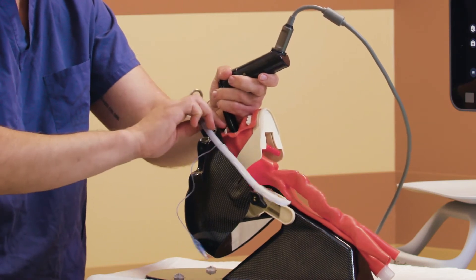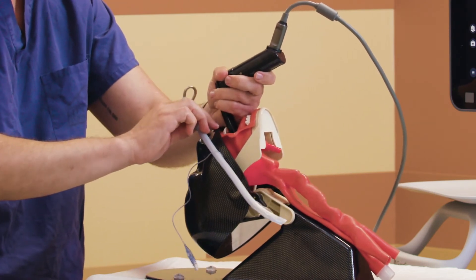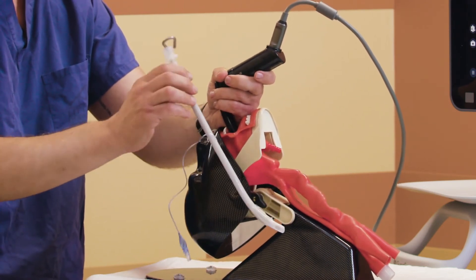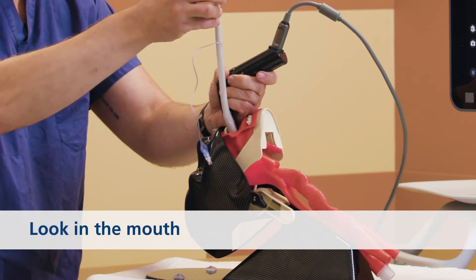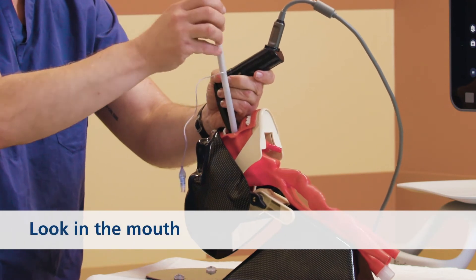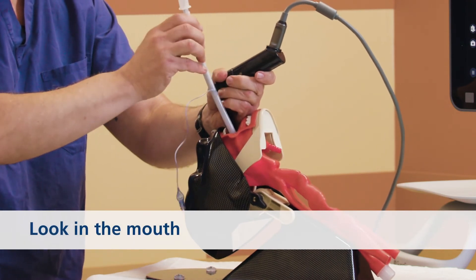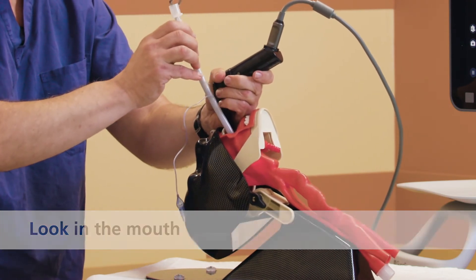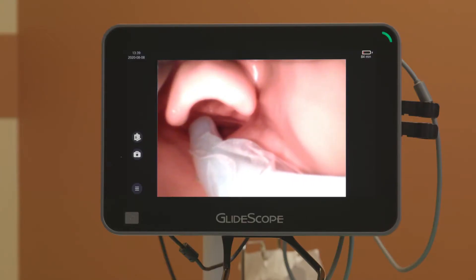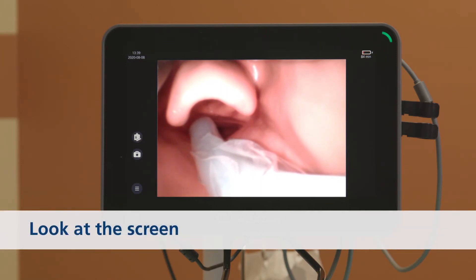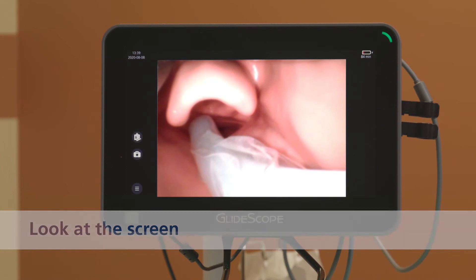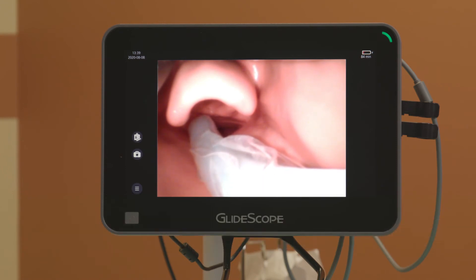If you pivot this centrally, you're going to hit the central dental arch, so we don't want to do that. We're introducing the tube and I come up from below the line of sight, and on the video monitor this is one of the terrific advantages of using a Macintosh video blade — you get to see, compared to direct laryngoscopy, you get to see tube placement much better.